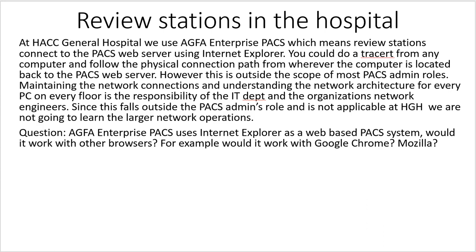So question, AGFA Enterprise PACS uses Internet Explorer as a web-based PACS system. Would it work with other browsers? For example, would it work with Google Chrome or Mozilla? You probably don't know the answer to that, so I'll give you the answer: yes. AGFA Enterprise PACS will work with Google Chrome and Mozilla. However, not all browser-based PACS do. For example, Fuji PACS. Fuji PACS is called Synapse, and Synapse only works with Internet Explorer. It doesn't work with Google Chrome, and it doesn't work with Mozilla.